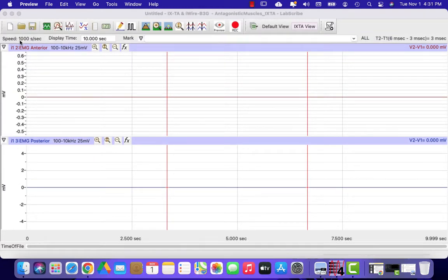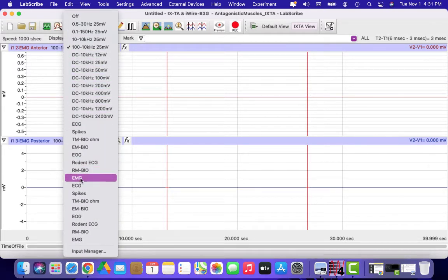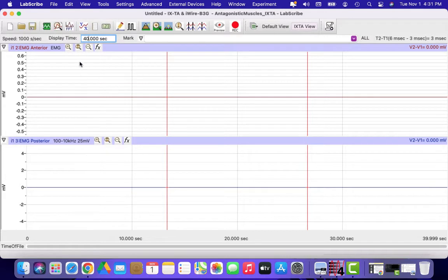There are a couple of settings that we need to change. The speed is fine, we can leave that. We do need to update our display time to 40 seconds, so type in 40 and hit enter. We also need to change the channel unit to EMG. We're only going to be running the top channel, so the bottom channel we can drag down since we're not going to be using it.